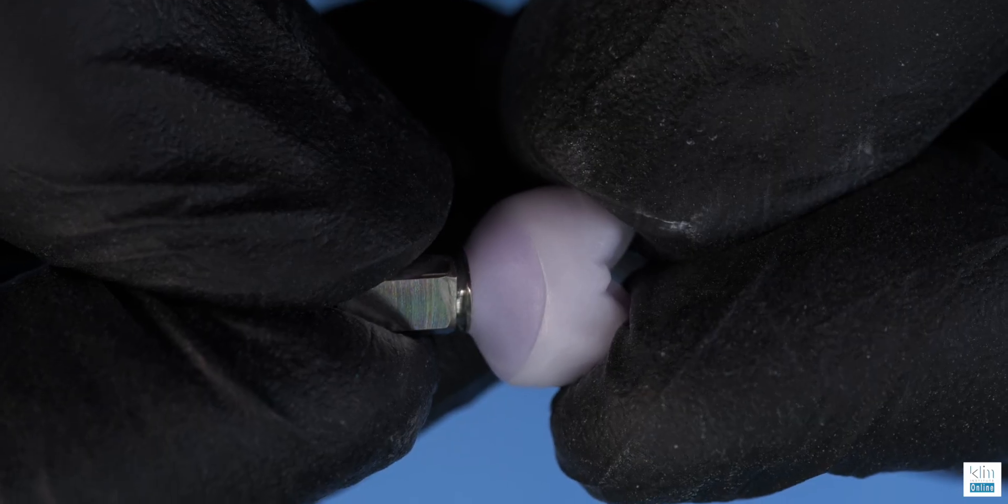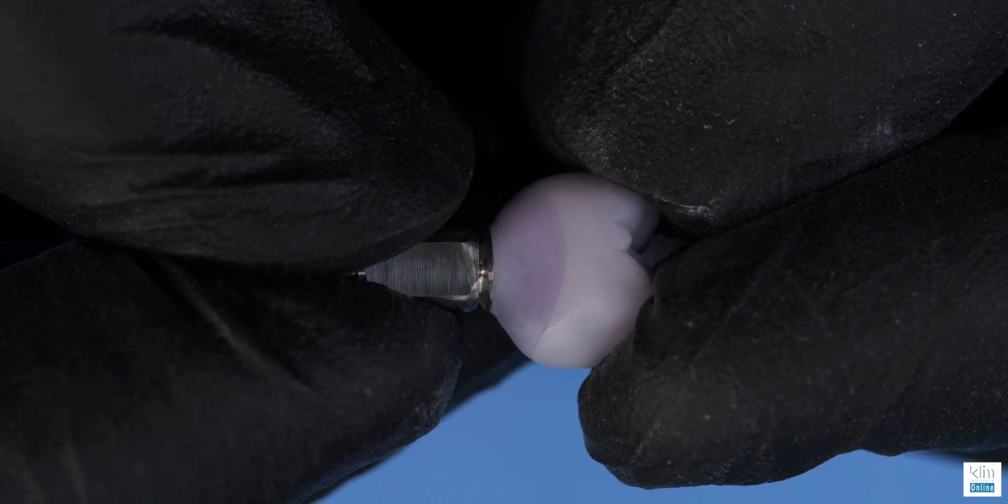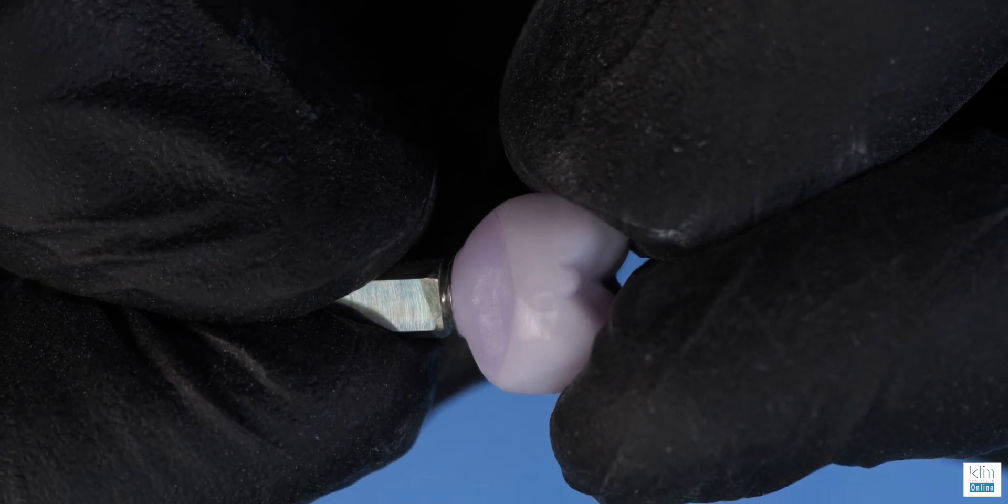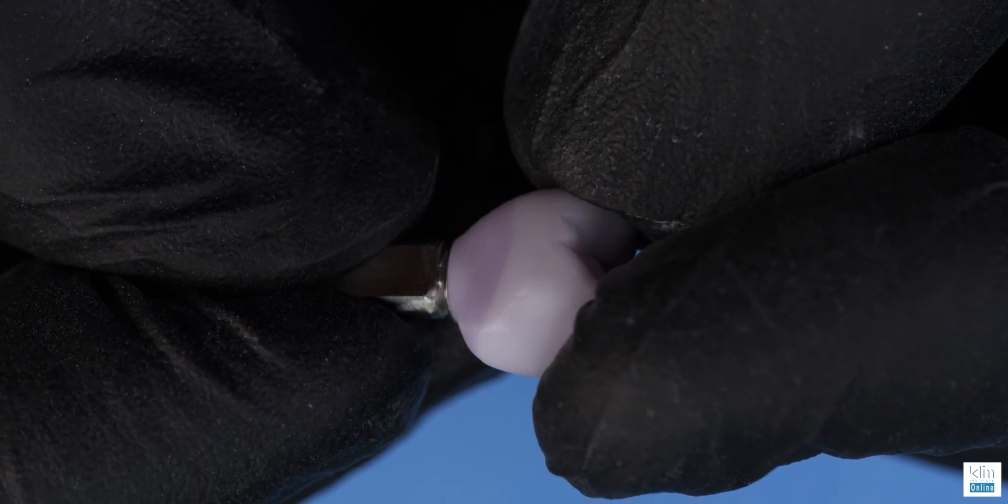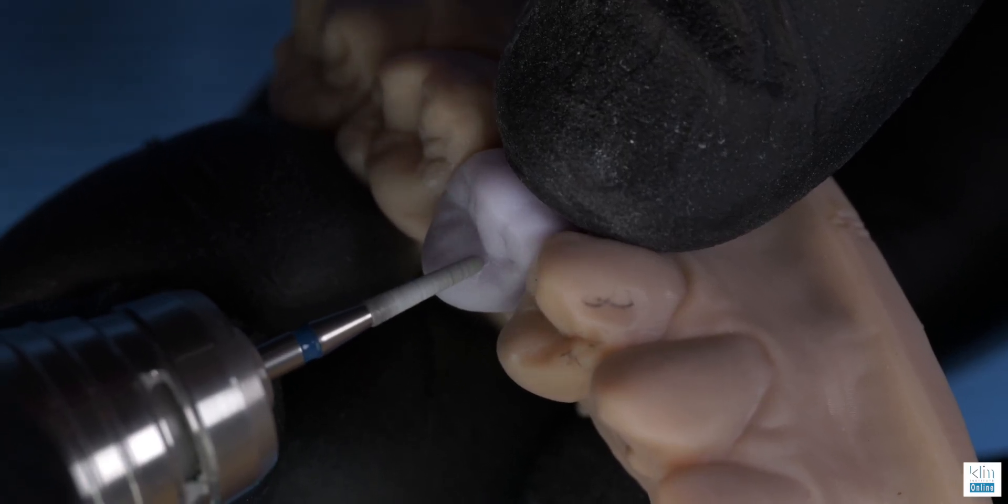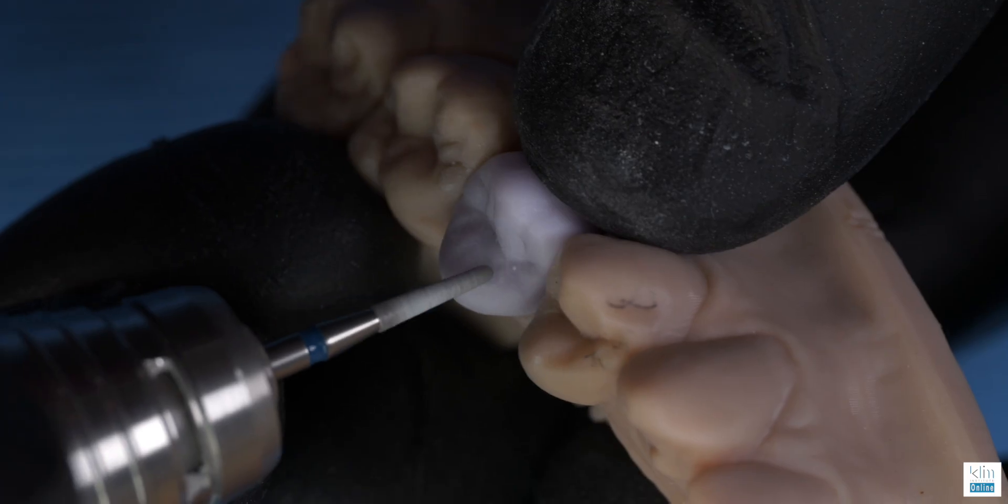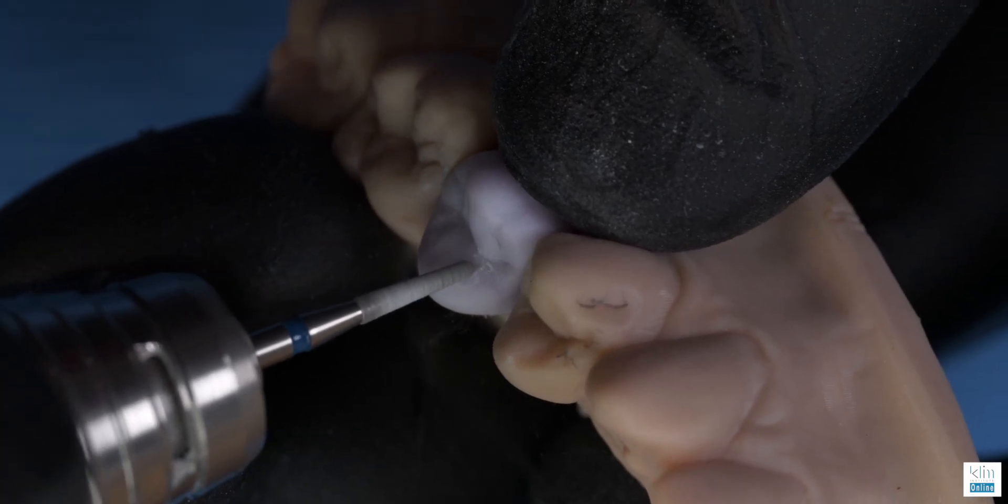And these are the fits that I expect with margin quality from CAD-CAM. This is what we get with the CEREC system every day in our practice. I love finishing, it's just a craft that I like to master. You can see that in this video. If we apply it just to the crown, that can be used anywhere in the mouth. Those are the techniques that we work through.